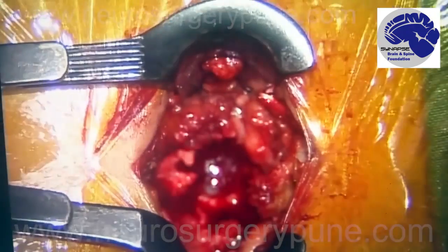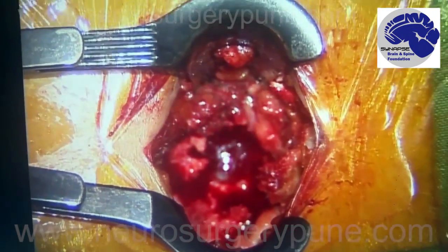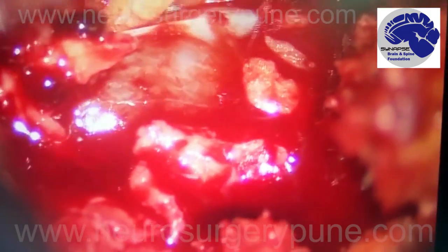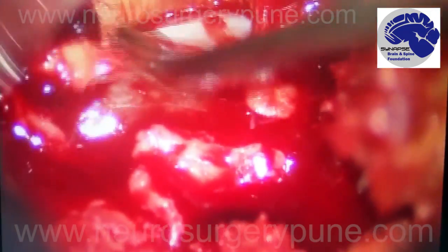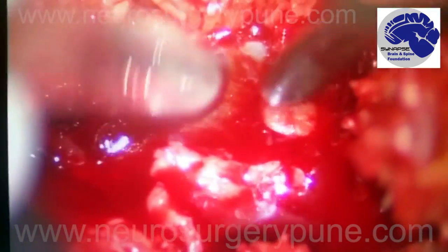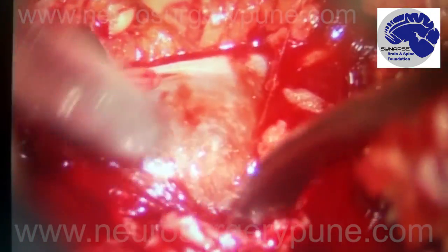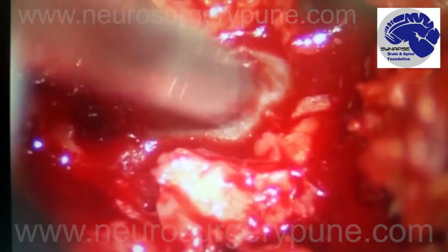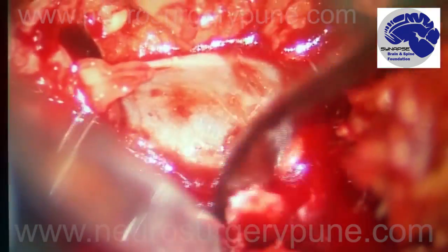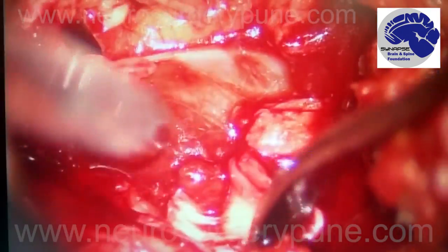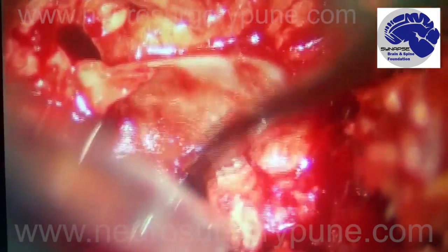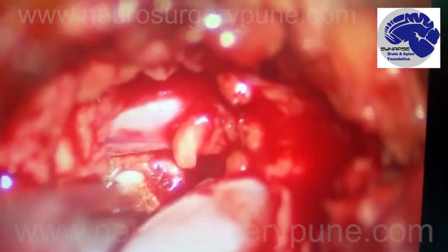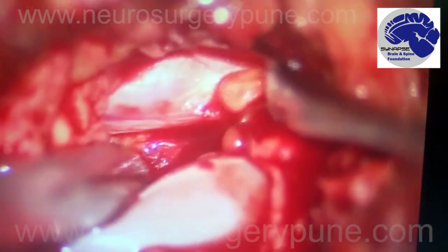It is about two and a half centimeters and what we see is a view under magnification of the neurosurgical microscope, which provides very high intensity illumination and magnification. This is the fat which is covering the nerves and we are slowly separating the fat and shortly we will be exposing the nerve which is compressed by the disc.